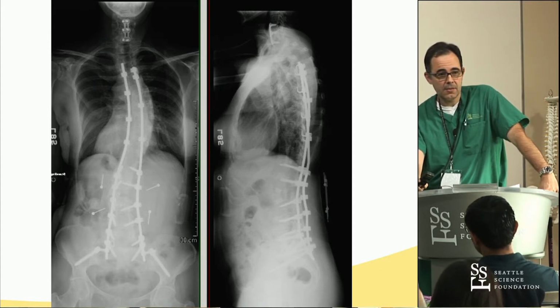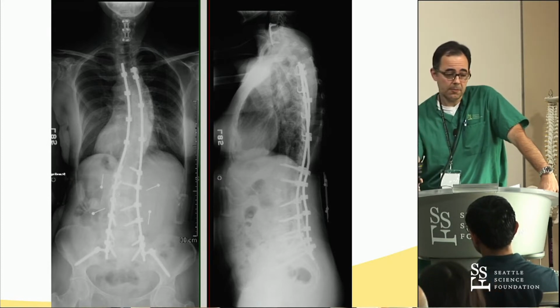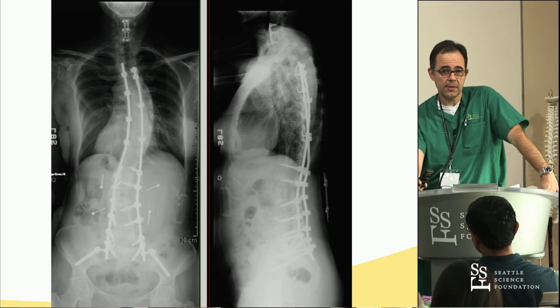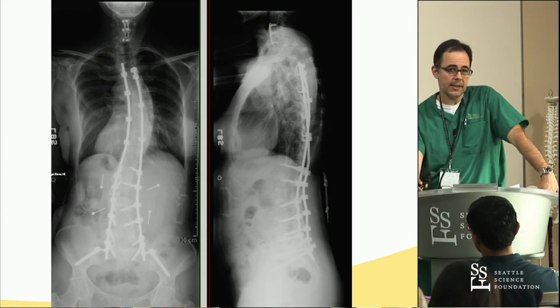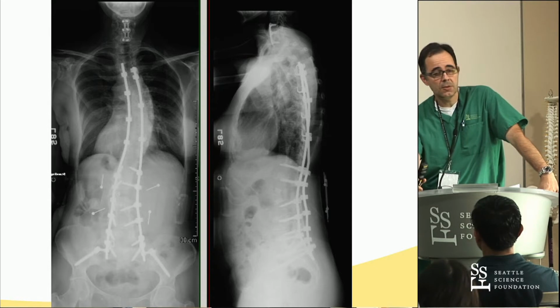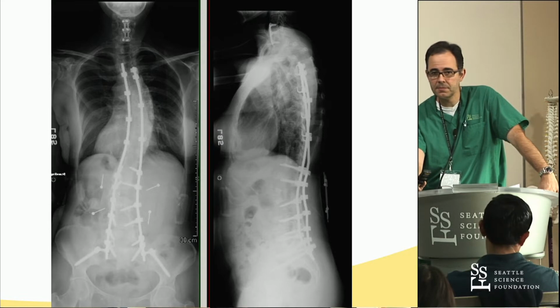process on that is stress at the SI joint. So if you put in iliac screws, then it's conceivable that there's going to be less stress on the SI joint. And if you put in iliac screws, you're less likely to get a sacral fracture. You know, with all of the stress that's being imposed from T2 to S1, I'm not sure what the risk is, but there would be possible risk of getting a pretty substantial fracture at S1 or below S1.